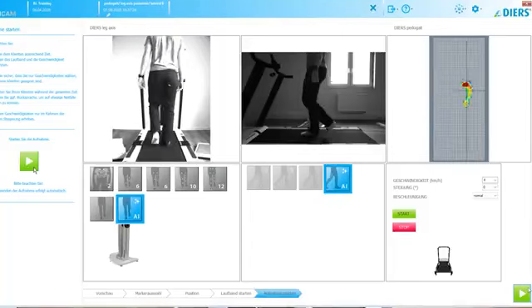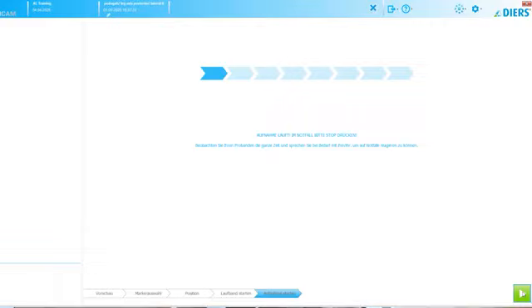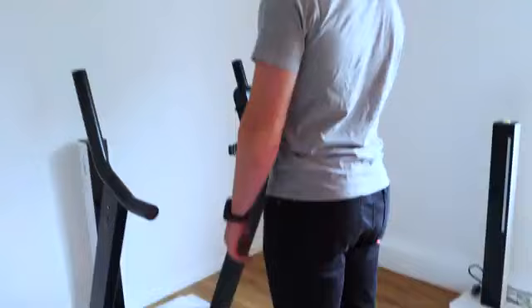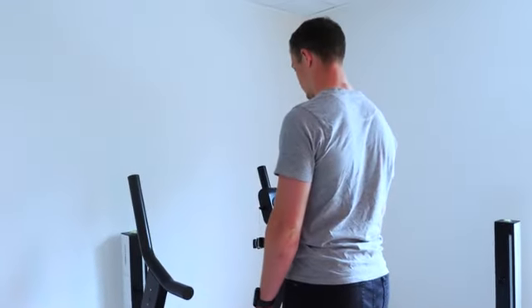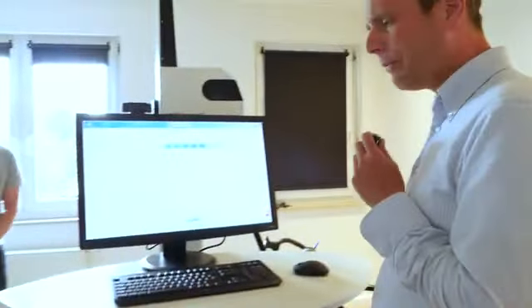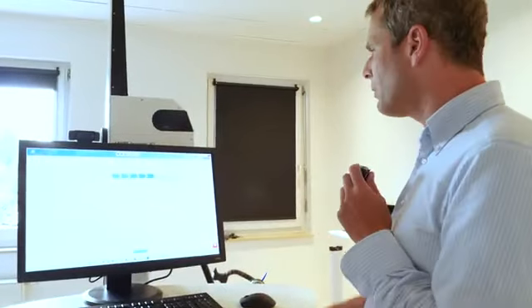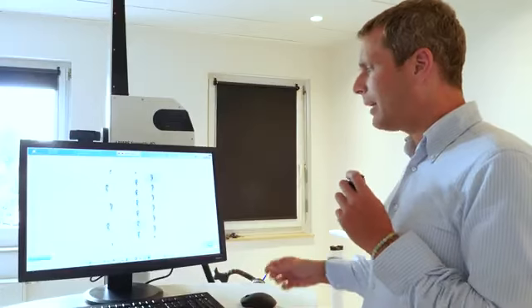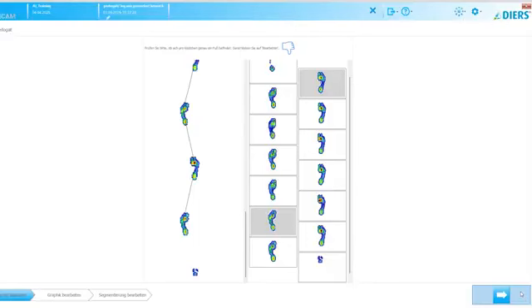I'm already starting the recording with him at 4 km/h as I said. I knew from previous recordings that this was his running speed, and accordingly, we have already performed the measurement quickly. As I said, pants on, foot pressure measurement was running, and now the system needs a bit to analyze this data. And yes, afterwards we'll take a look at the whole thing.